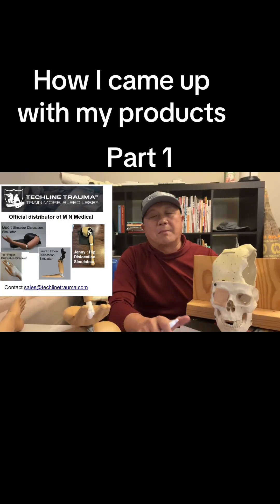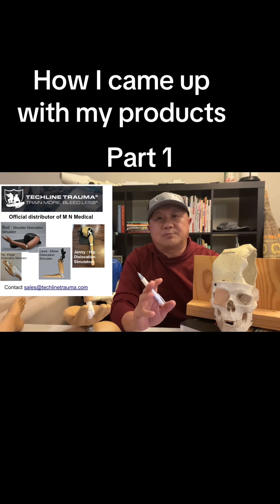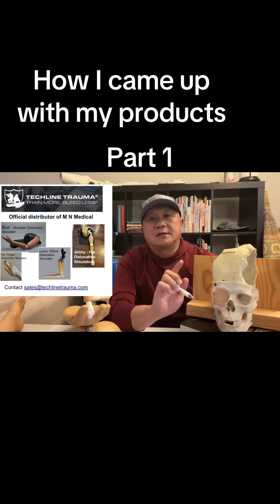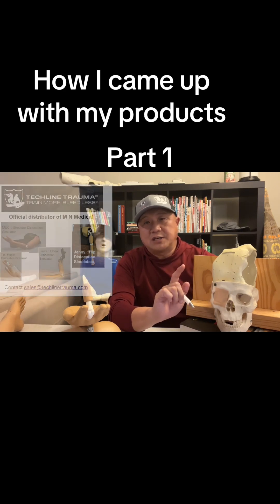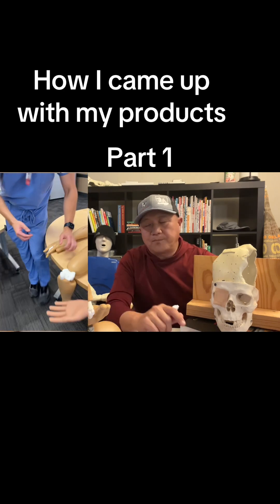Hey, this is Toki from M N Medical. Today we're going to talk about how I came up with this crazy product I have: the shoulder dislocation simulator, elbow, finger, and the latest one is the Jenny hip dislocation simulator. You will see them here in the video.